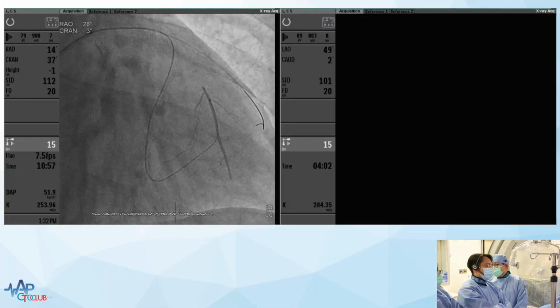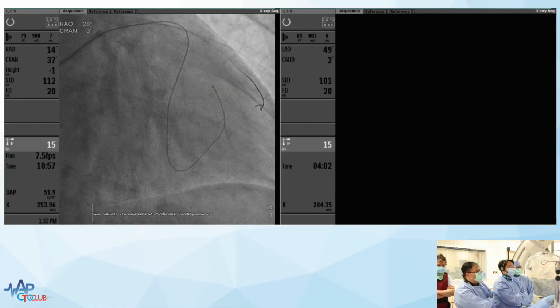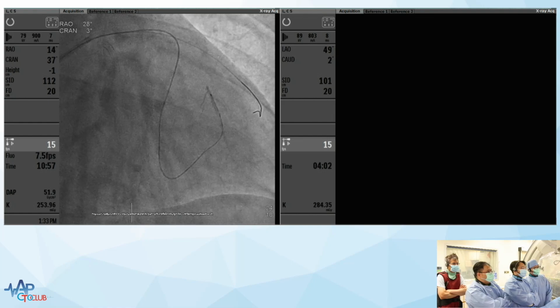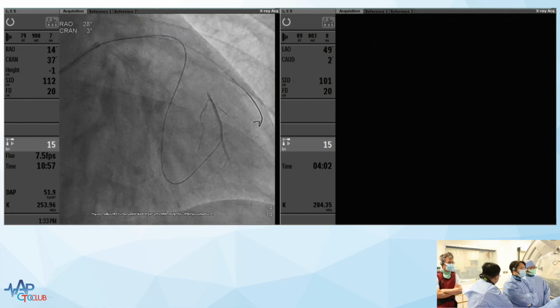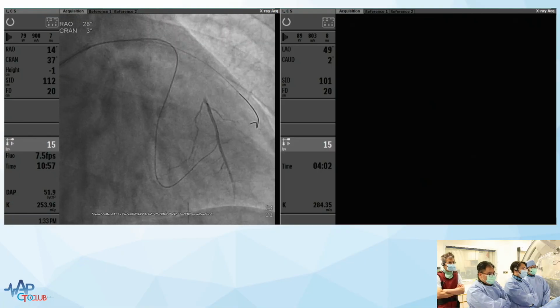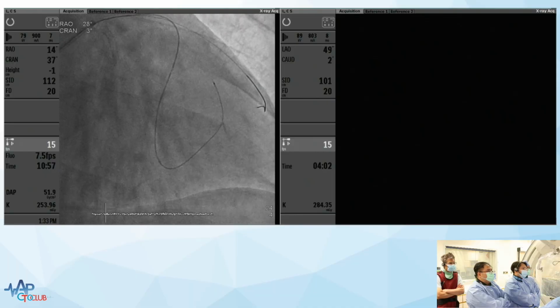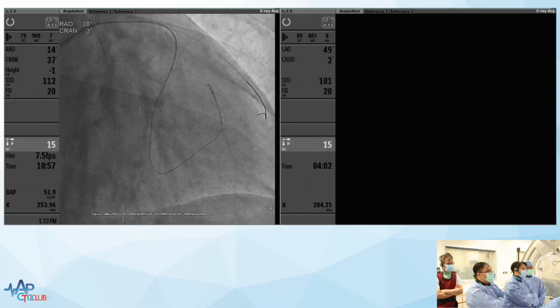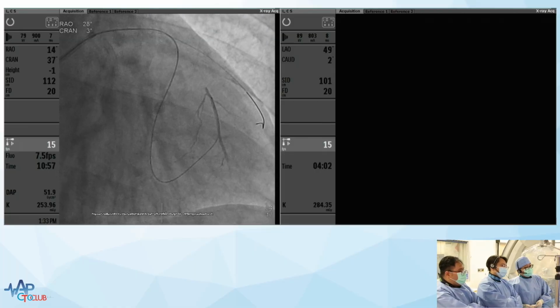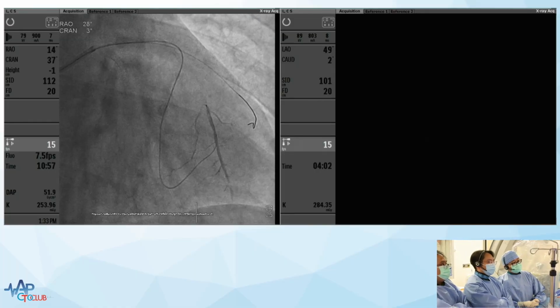Okay, sorry, too fast. No, sorry. I think it's very debatable how you should progress from here, right? It'd be interesting to see. I mean, I can foresee a number of problems. So maybe Dr. Matsuda, now we've got to this part, how would you progress the case, and what problems do you foresee?